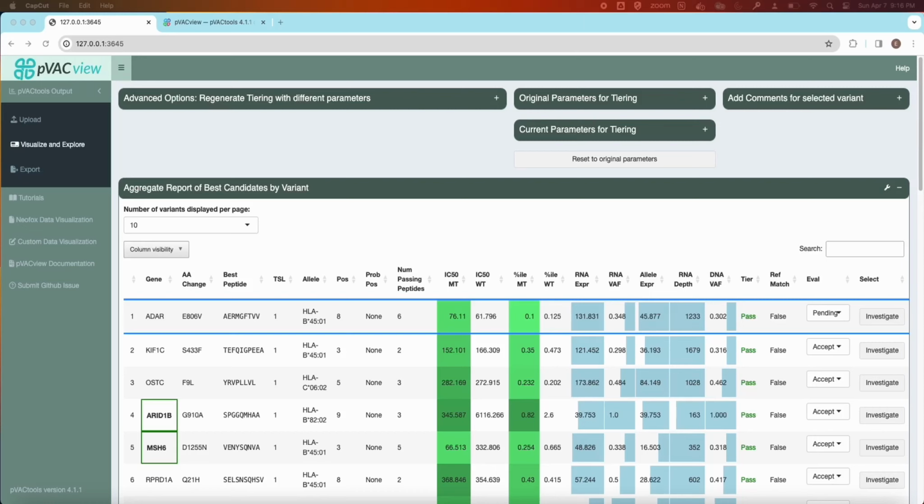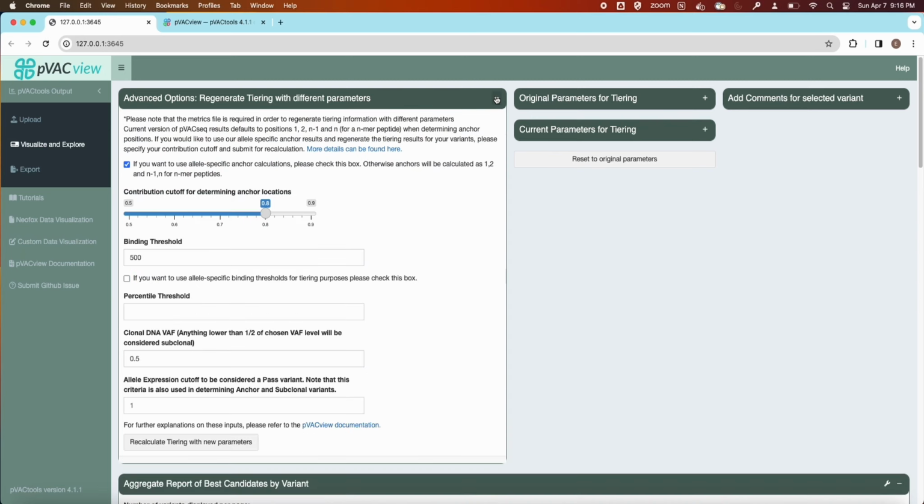Welcome to part 5 of the pVACview demonstration. In this video, we discuss advanced options and how to export evaluated candidates. We have some advanced options to allow users to update the tiering of each candidate to their specific needs.